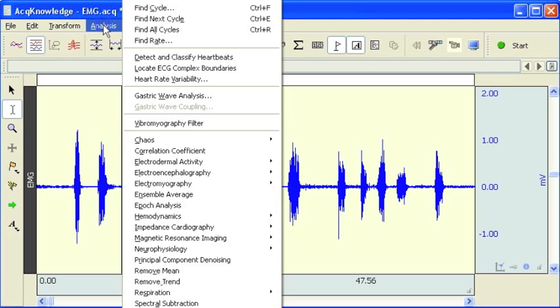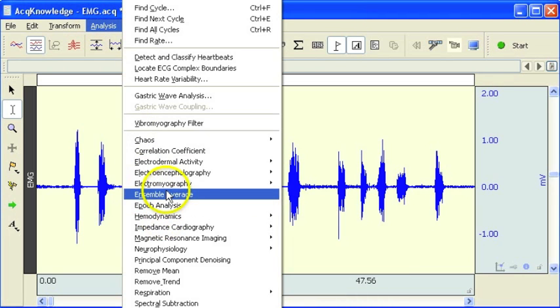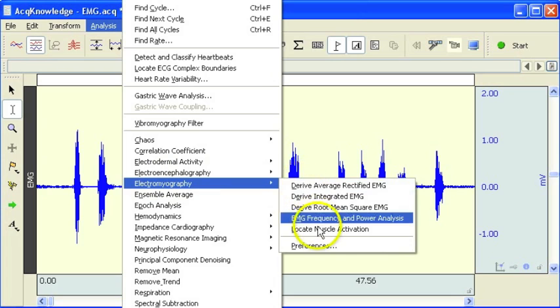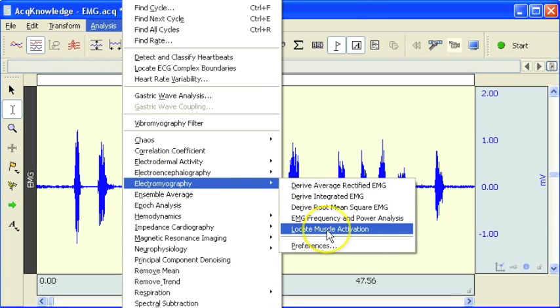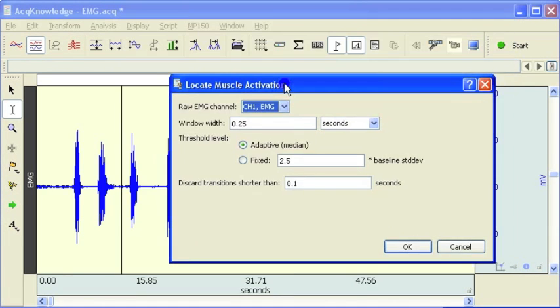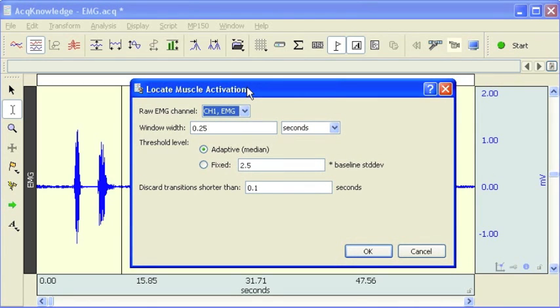If we go to the analysis menu, to the EMG or electromyography submenu, there's an option in there, Locate Muscle Activation. When you select this option, you're confronted with a new dialog box.